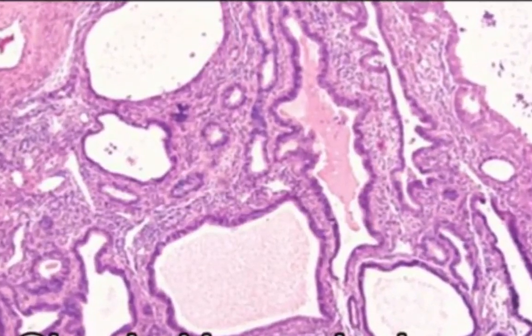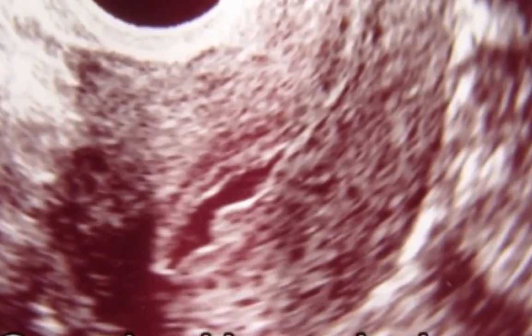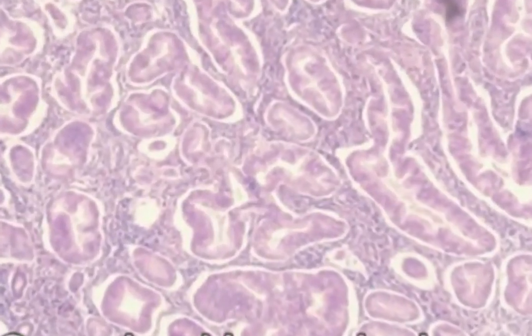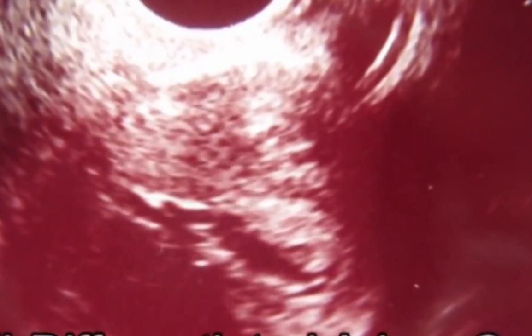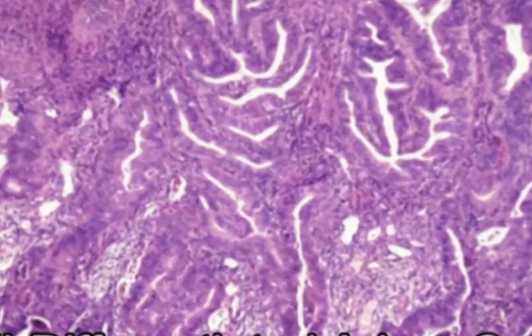When sonohysterography is performed to evaluate abnormal bleeding, a thin lining, less than 3 millimeters on each side, is reassuring that hyperplasia is not present. If each hemilining is 3 millimeters or greater, then endometrial biopsy will be needed to reach a precise diagnosis. While the use of sonohysterography may reduce the need for endometrial biopsy, it does not eliminate it.